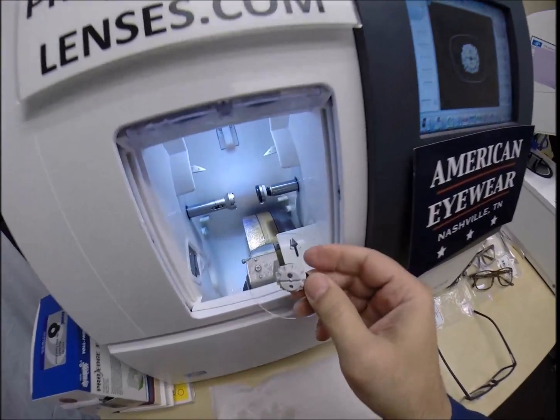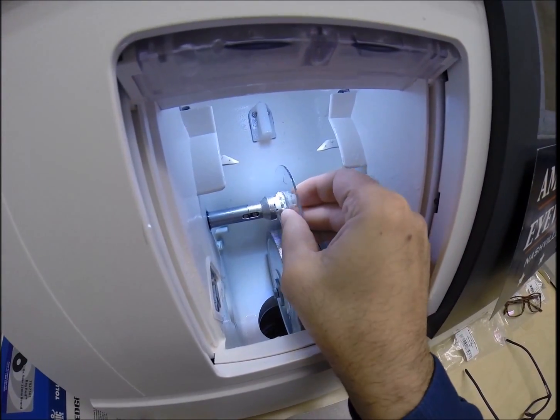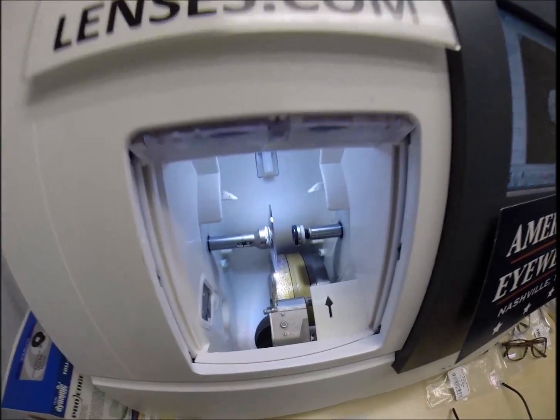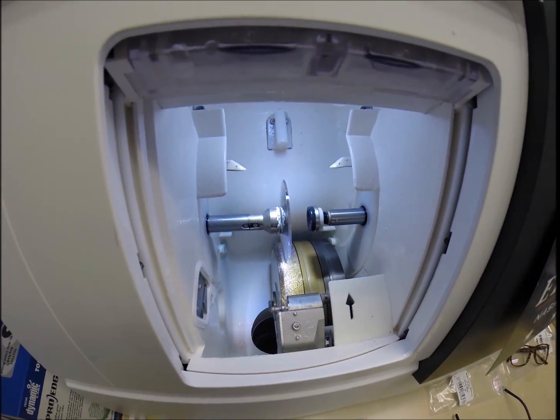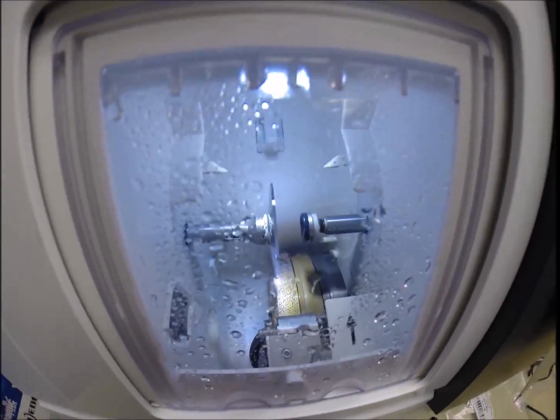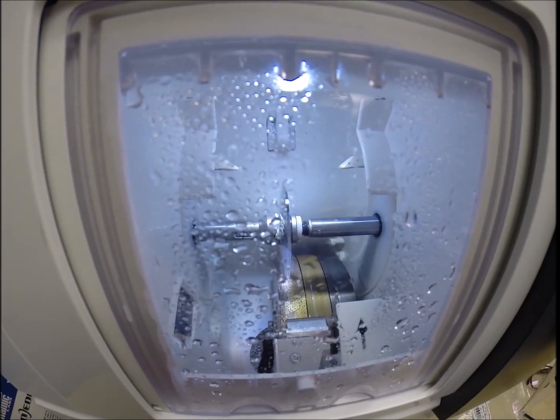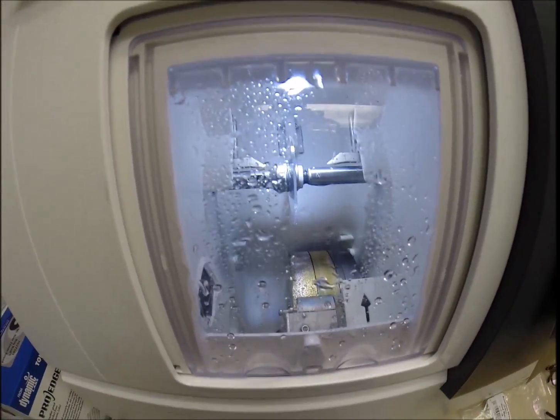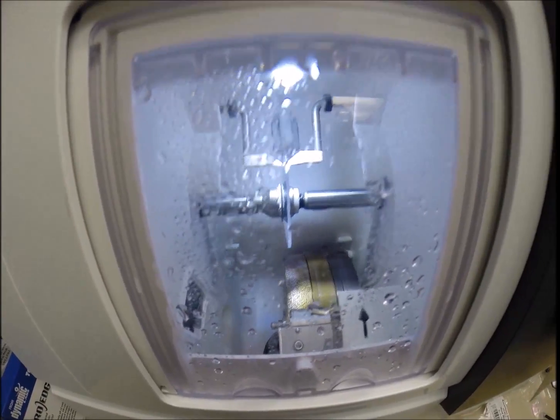Press that on there. Put the magnet into the Chuck, the Charles, the Chucky baby, the Chuckster, the Chuckarama. Okay, this is not Saturday Night Live. Let's hit the green arrow, which is start in every language. Chuck's making a copy. The Chuckinator. So, alright, I'm just here to entertain myself.